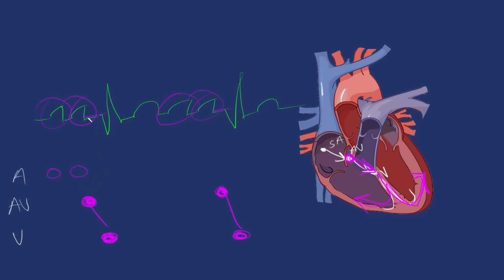And eventually what happens is one of these goes through, and it drops into this. So we have this one here, and then it drops. And there might even be one hidden in here occasionally, but for the sake of this, we're just going to use this. So we have atrial, atrial, and then one of them goes through to the AV node, and that kicks that down to the ventricles. This here, if we flip this upside down, or even just looking at this, it looks like shark teeth or shark fins. This is atrial, so we know it's starting at the atria. Flutter.